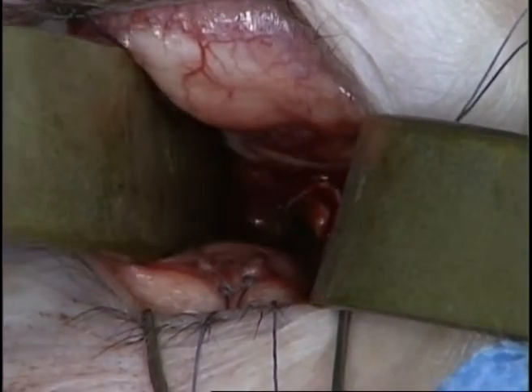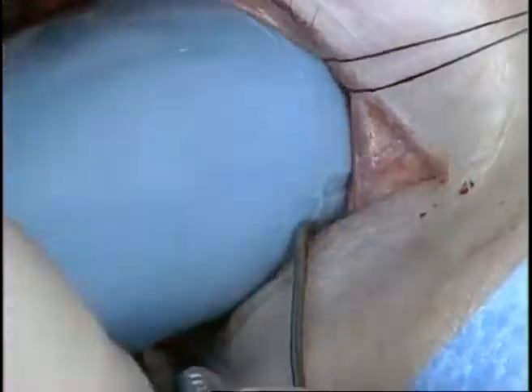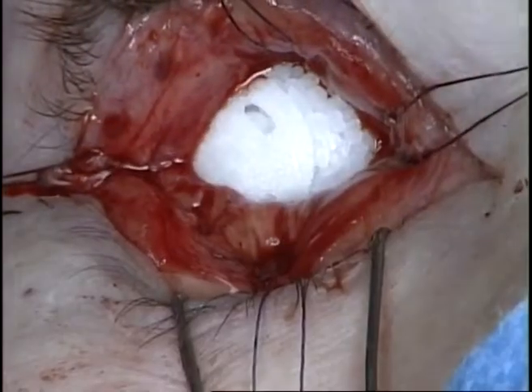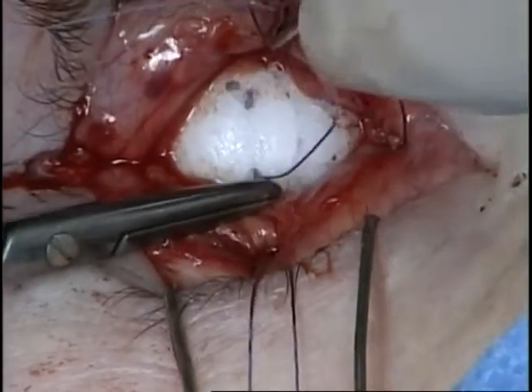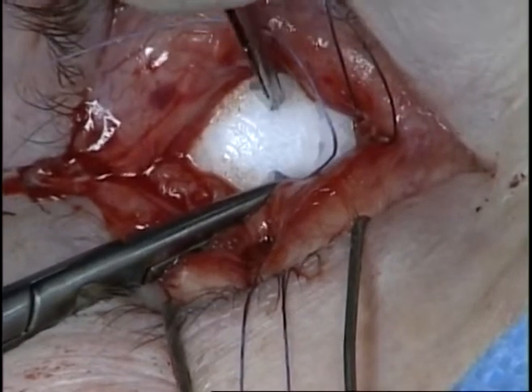A 22 mm porous polyethylene implant is then placed. This implant has pre-drilled holes to which the rectus muscles can be attached. It is useful to pass the needle backwards through the pre-drilled holes for ease of passage.